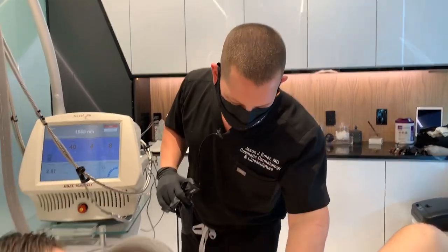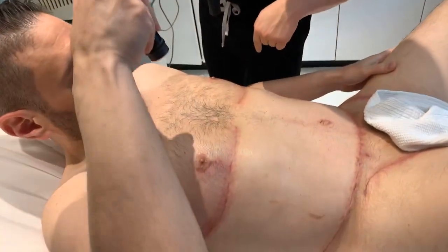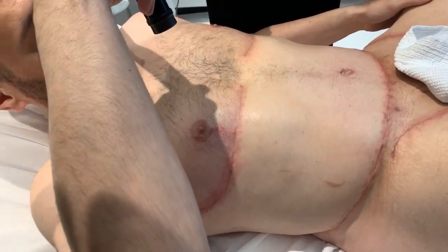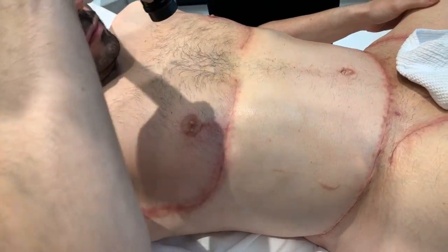So again, take a look up close. He's cooling now. We want the redness to go down. But all these areas have now been lasered. And the goal is to remodel those scars so they're basically invisible at a year.